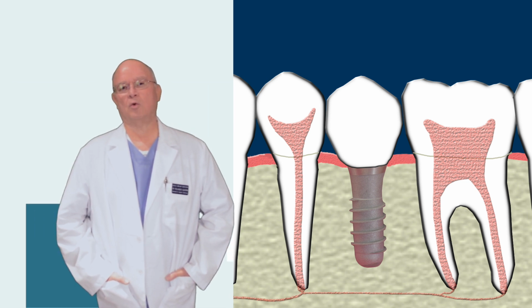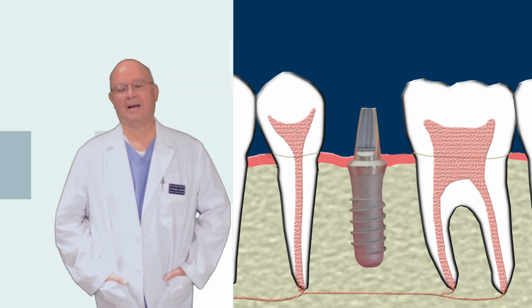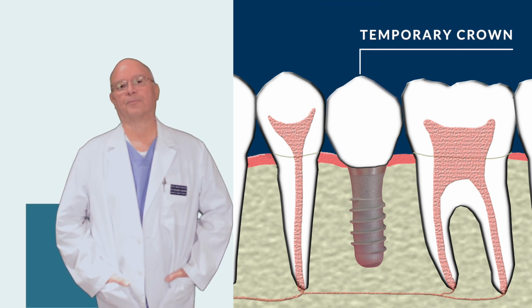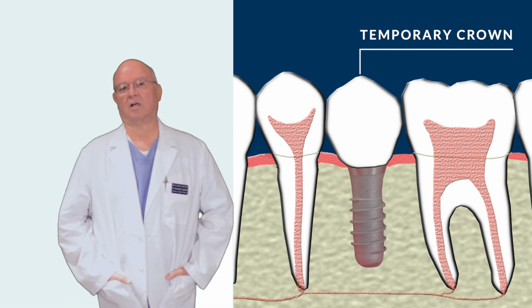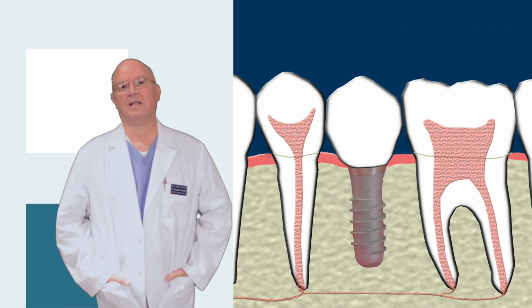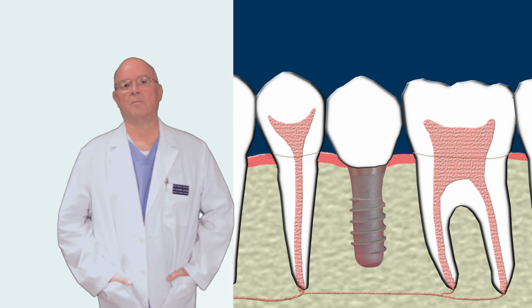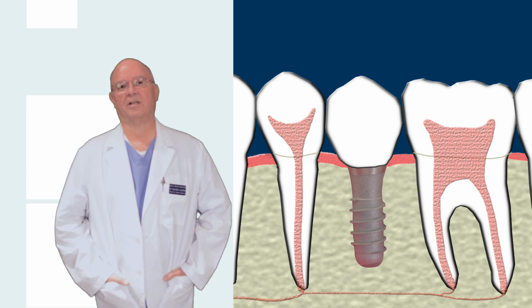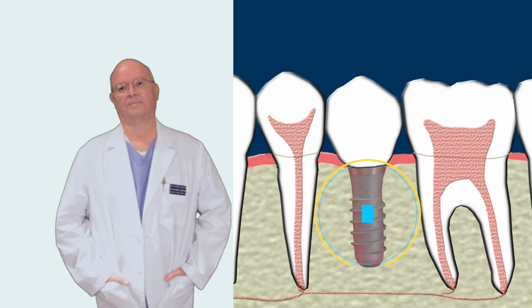The way that you would keep from having an empty space in your mouth while you have an implant and you're waiting for it to osseointegrate would be a temporary tooth made out of composite, which is a special acrylic used in the dental office that can take the place of the tooth or teeth that you're missing. It works very well and looks very nice, but for the most part, it is a temporary restoration until the implant has been grabbed by the bone in this process called osseointegration.